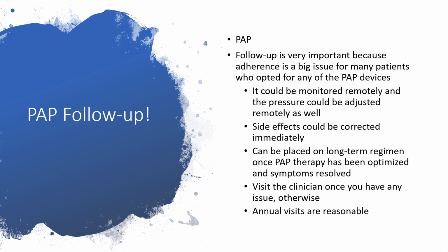And some will not be honest as to whether it's being used or not, particularly in places where the elders have been abused. Maybe those elders are supposed to be helped with applying the CPAP before sleeping, and with all due respect, whoever is looking after the person is not doing that.